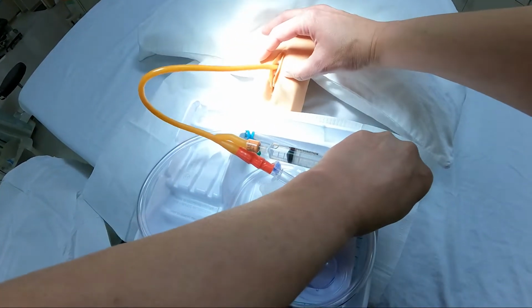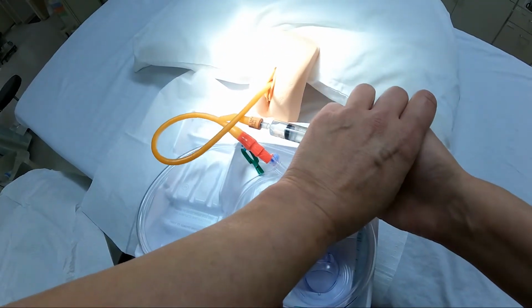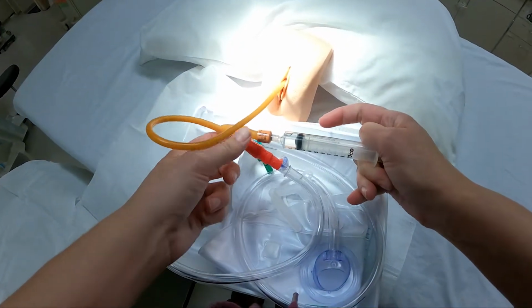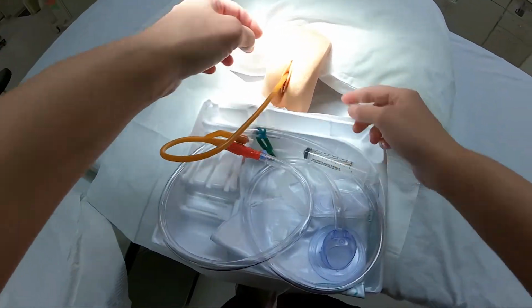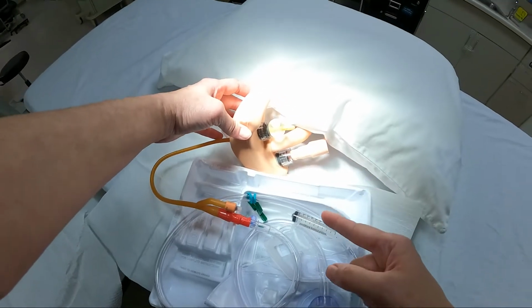And your patient shouldn't be yelling, ow, ow, ow, it hurts. And you shouldn't be seeing blood come out of the catheter. That's all a problem. Or if you meet unusual resistance, stop sooner rather than later. So that's in there, and the catheter's in. And as you see, the balloon is right there in the back, so we're in perfect position.